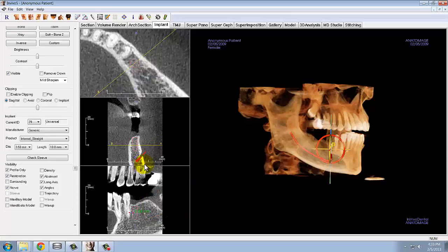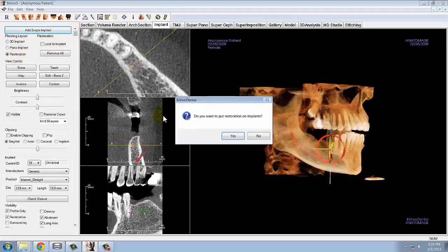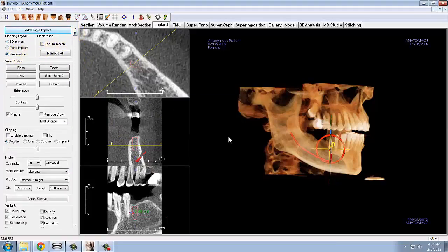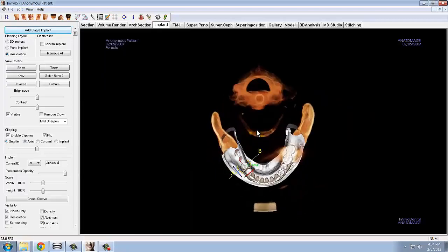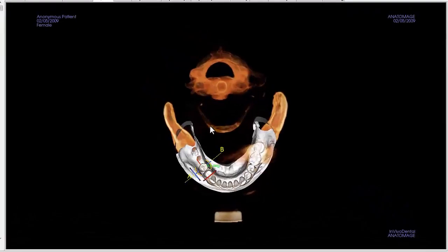Now that you have added in the implant, you can add virtual restorations by switching to the restoration view in the control panel. A widget will appear that allows you to move the restoration so that it is in line with the other teeth in the arch, as well as adjust its angulation.